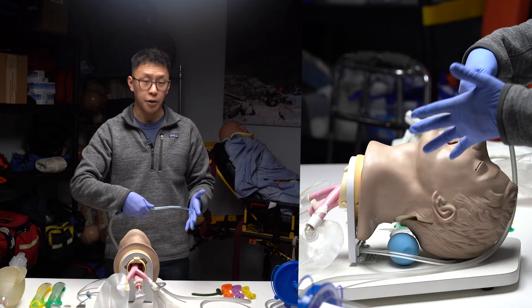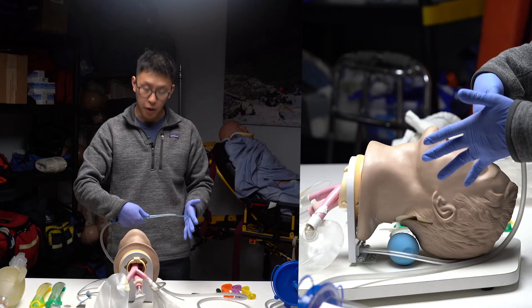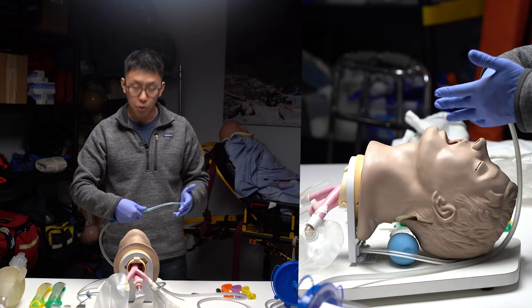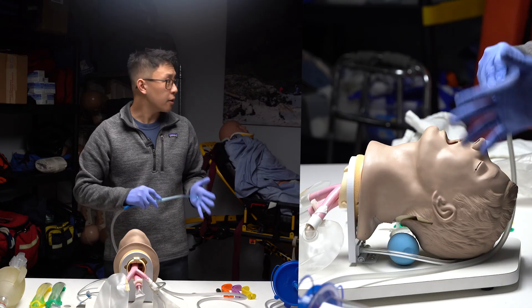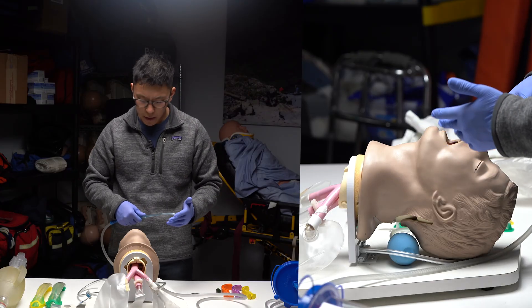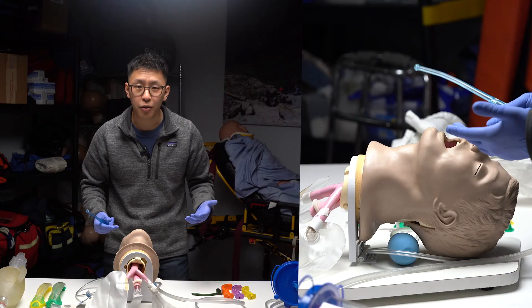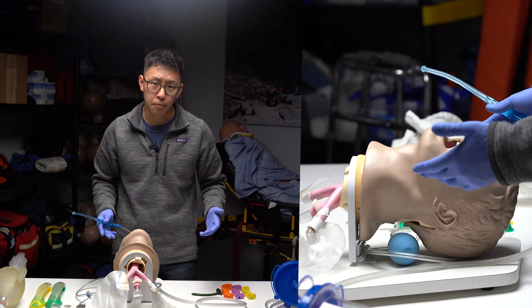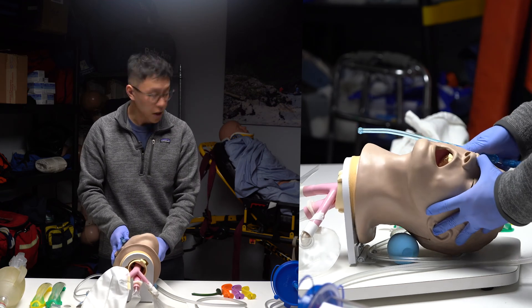Verbalize that you turn on the suction device so it's making a loud humming sound, then test it on your gloved hand by occluding the distal tip and the hole. After that, we want to see you open the mouth. These mannequins have their mouths wide open, but remember that most unresponsive patients' mouths are not wide open.